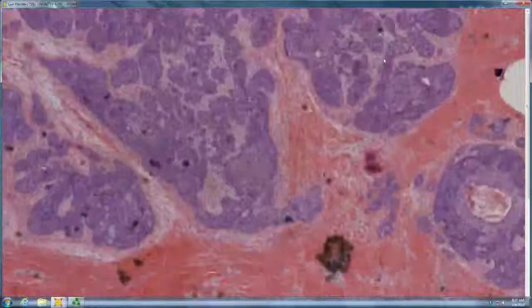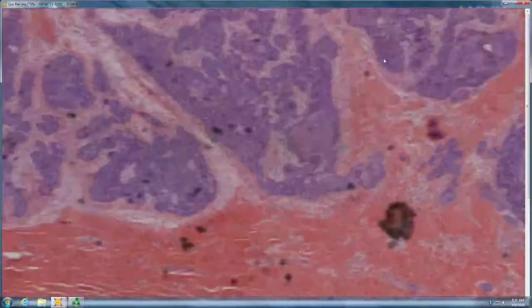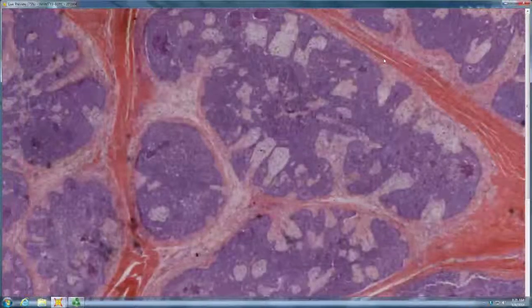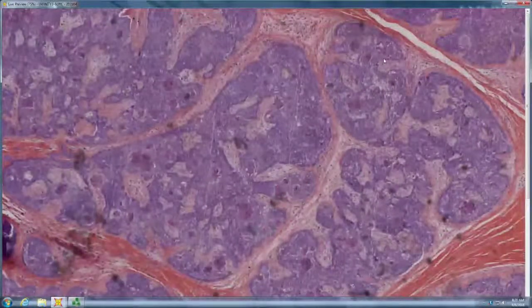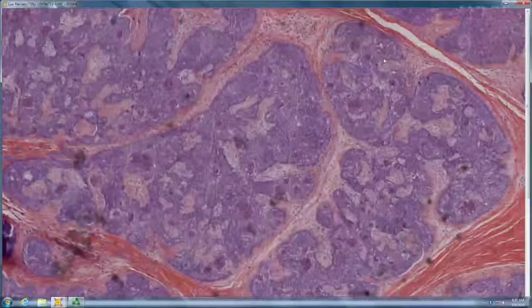Really eosinophilic stroma, surrounding the hair follicle and the tumor island. It's a trichoblastoma. So it is a big basaloid tumor. The only clefting is in the stroma. It has a concentric fibroblast-rich stroma. It's a big ball, so you are correct. It is a big trichoblastoma.